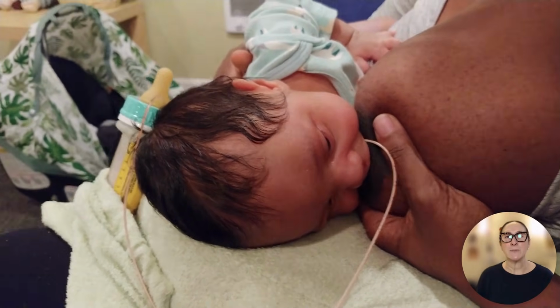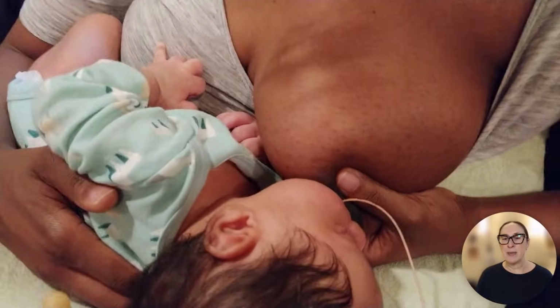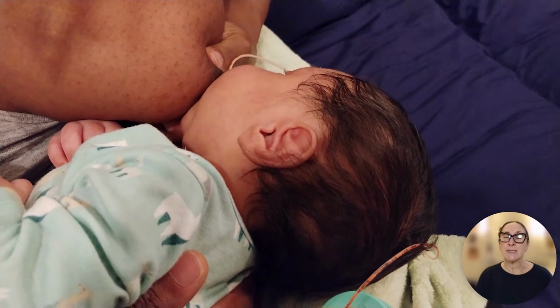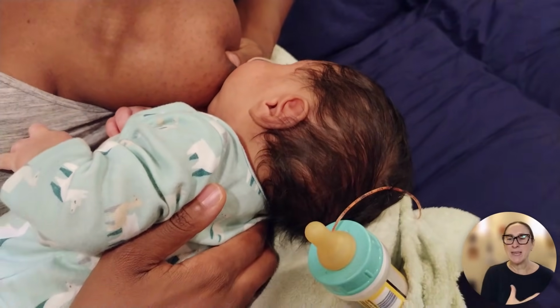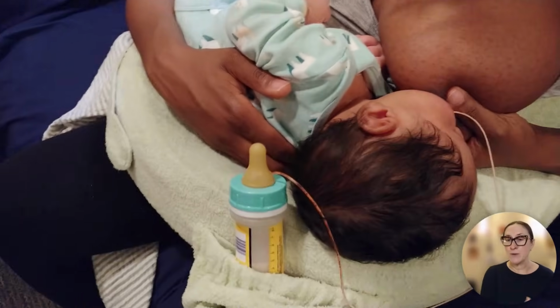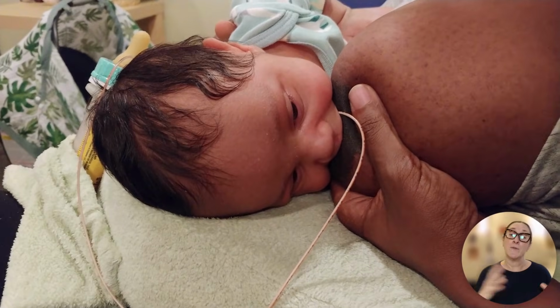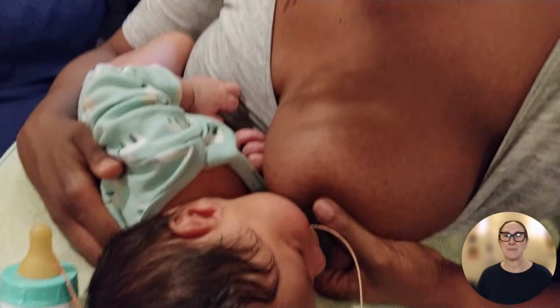Here's a video clip showing a baby using at-breast supplementation, and this baby was a latching baby. He was dealing with some issues, and the parent also had low milk production. We were able to have the baby latch and then slip the little tube in so he was able to get any available mother's milk and milk from the tube. You can see how actively he's feeding and how he's able to really get all the volume he needs with supplementation at breast with this setup.